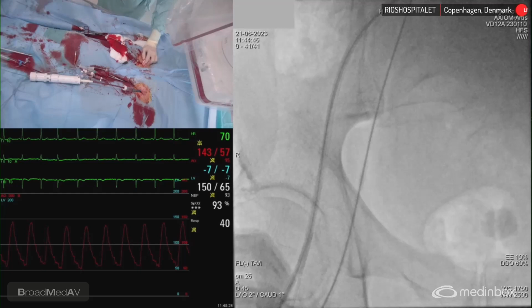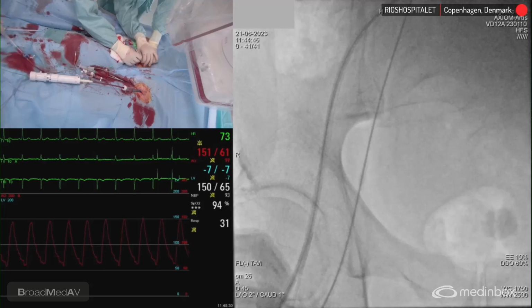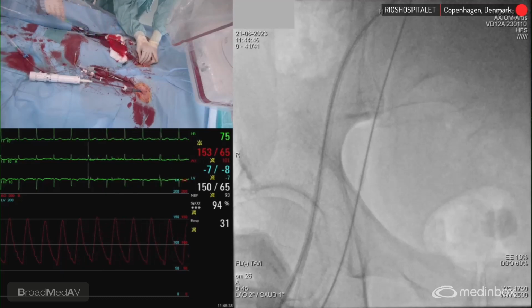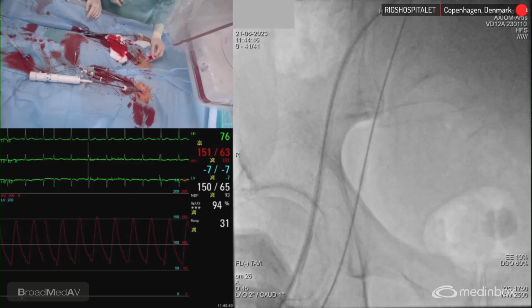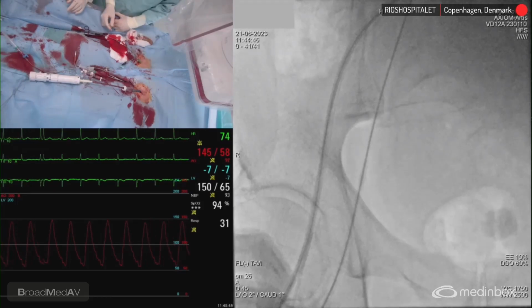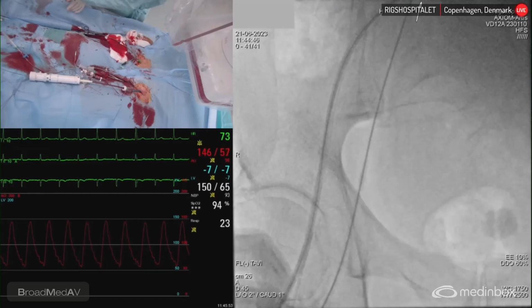Yeah, put it down. So the idea now, because the valve is very constrained and it's really risky to take out the stent holder from the LV just like that, we may risk embolizing the valve and we don't want to take that risk. So we're going to cross now from an additional access. Now you can use a stiff wire or super stiff, or we can do it through a catheter.